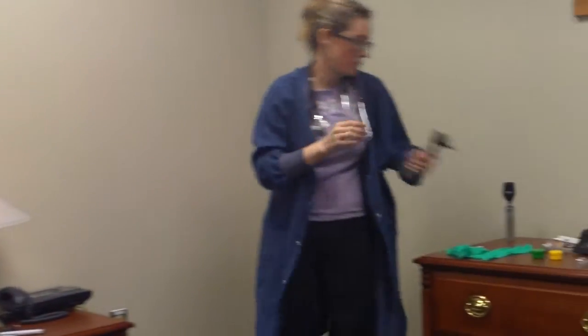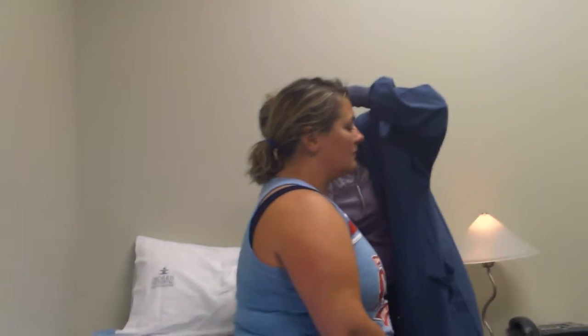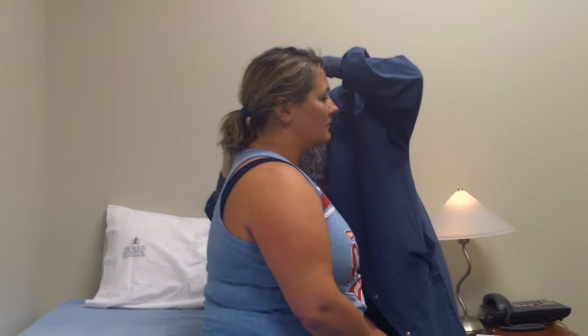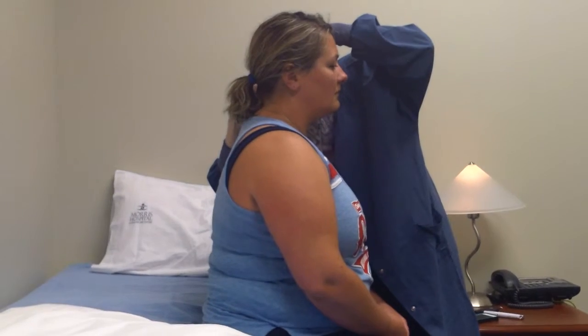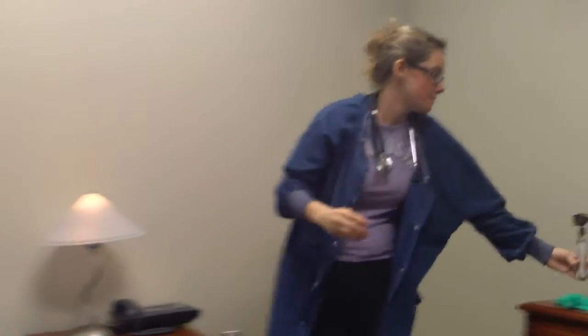So I am going to look at your ears with the otoscope. The external part of your ear canal, I can see some mild cerumen and some hair. And then when I look at the tympanic membrane, it is a pearly gray. There's no evidence of bulging. There's no evidence of any infection.